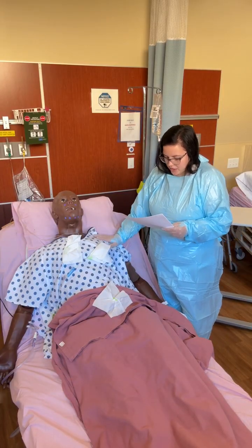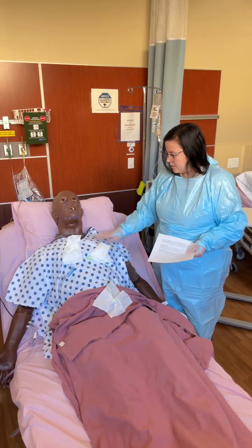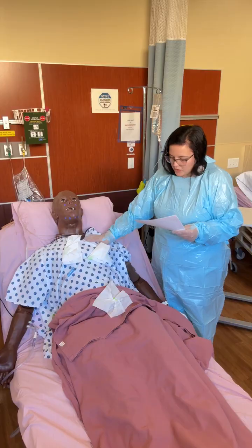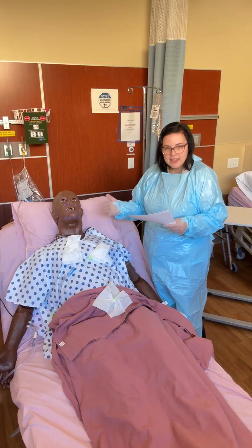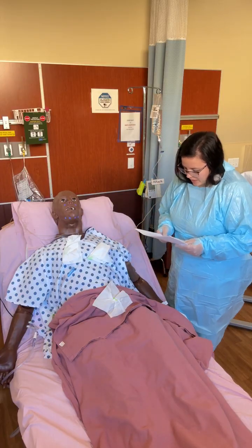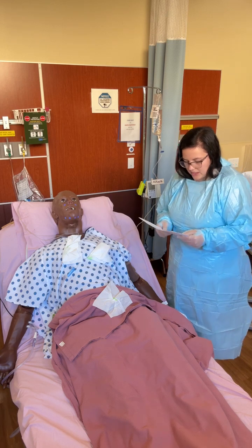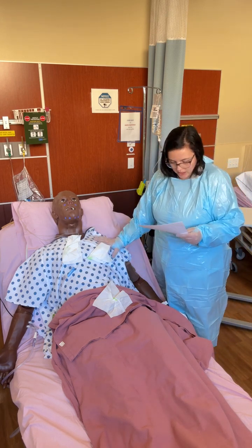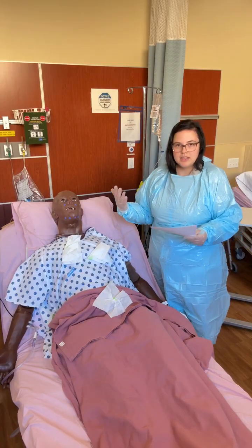This simulator has chest rise, so you can see when he's breathing, his chest will rise and fall. And then he also has a respiratory rate that you can listen to and count using your stethoscope. Just remember that when you are listening to the lungs, you will want to listen to all the lobes on the anterior portion, and then you will confirm with the sim staff.